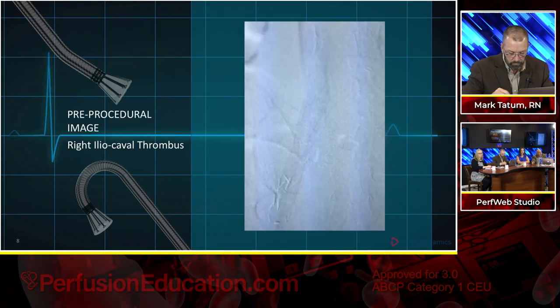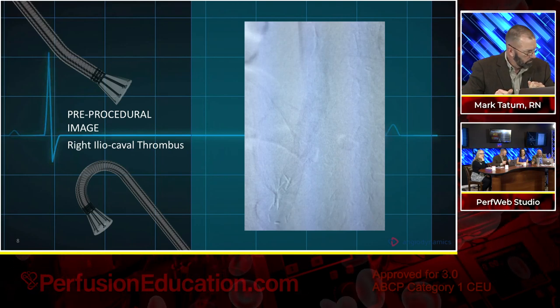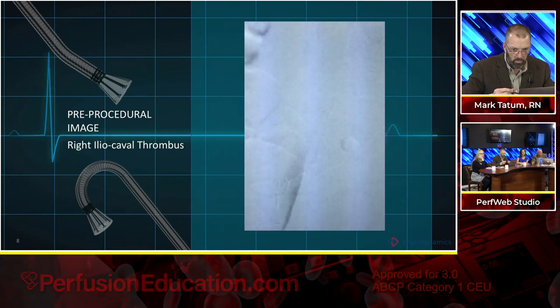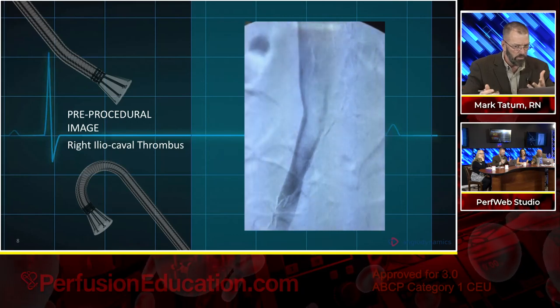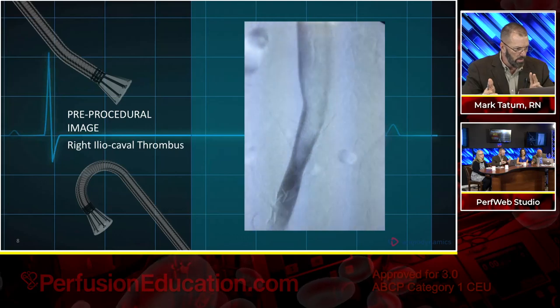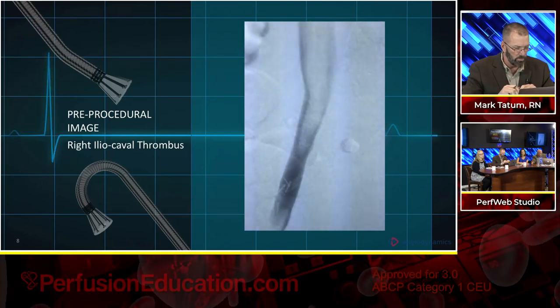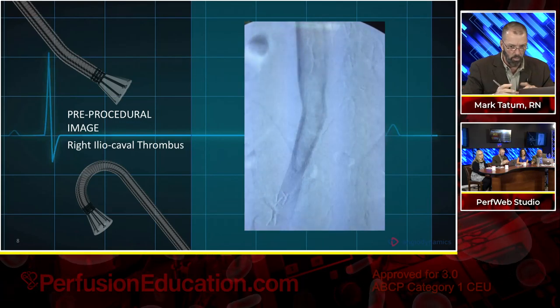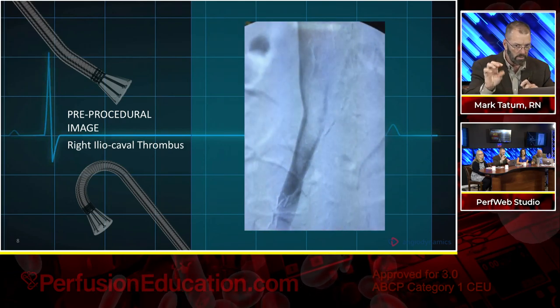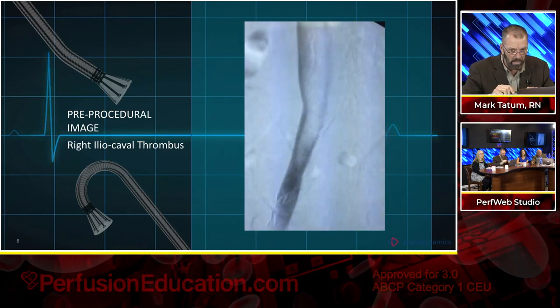Okay. So in this, now go to Slido. This is where it's an active poll right now. Let's give one more click, and this will show us the actual live image. So this is that patient. This is what we were looking at before. What we can see is that we've got venography here. It looks like likely digital subtraction, so you've got that in the background where you can really see the contrast go through. And the area, I'm without a pointer, but I think pretty much everybody's going to be able to determine the area that is not smooth and clean and normal filling with contrast, and that would be the area of clot that we're looking at in this patient.